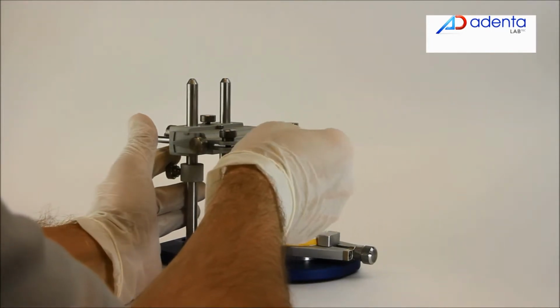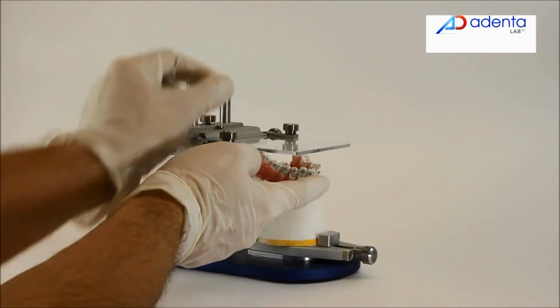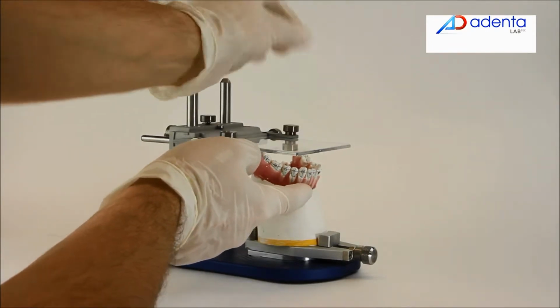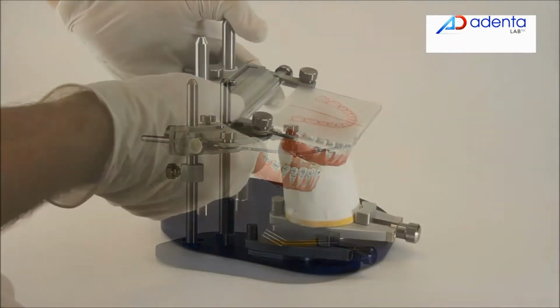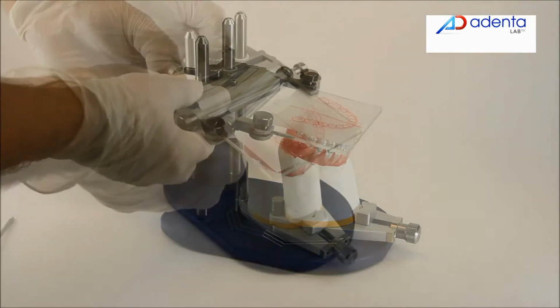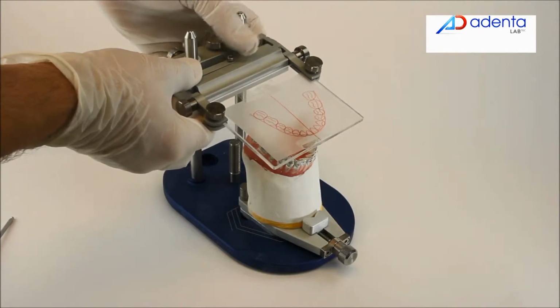Then use the occlusal acrylic plate as a reference. Use the multidirectional adaptation appliance and stick the occlusal VTO to the acrylic plate and then fix it into the position of the lower setup model teeth.